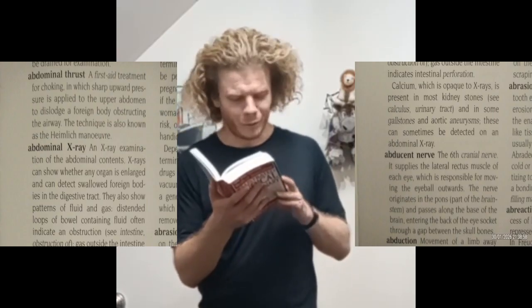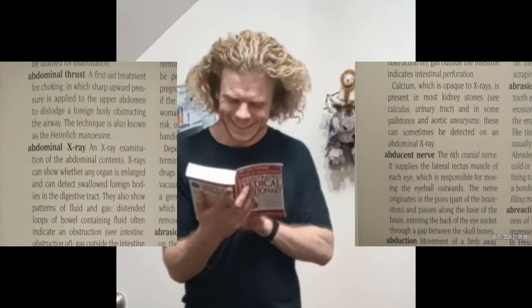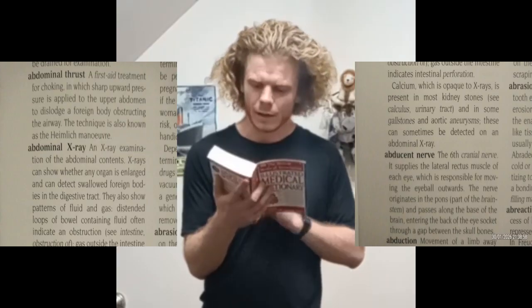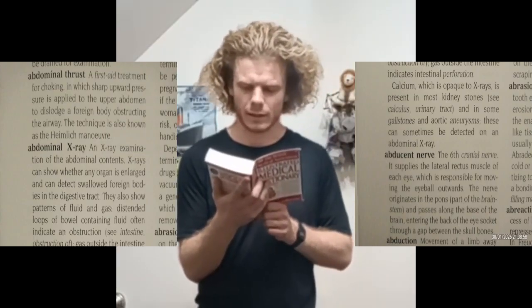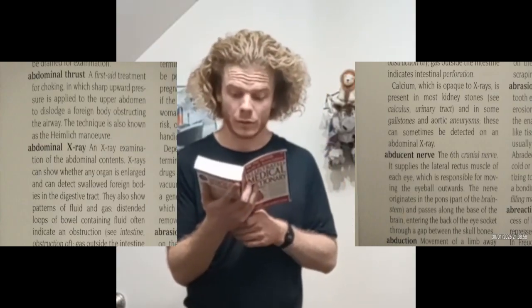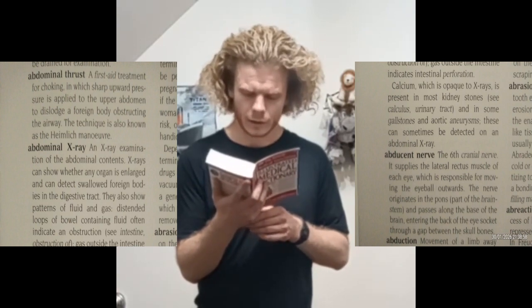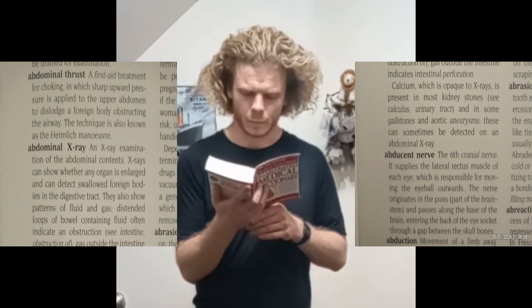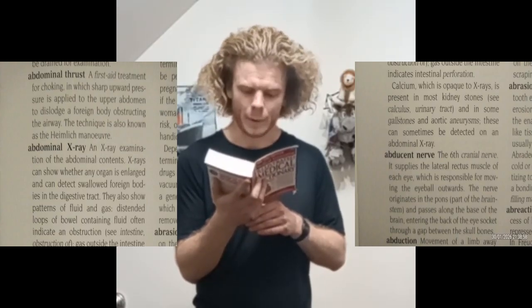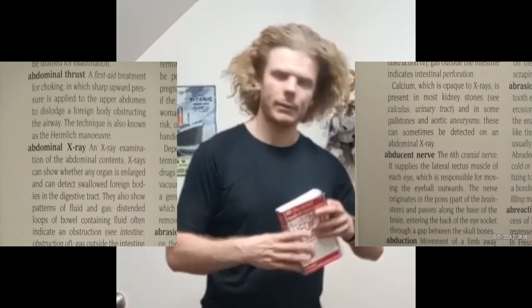A hole made in an organ or tissue by disease or injury. If there's gas outside of the intestine, that could indicate a perforation of the intestine. And it can then show calcium, which is opaque to X-rays, so kidney stones can maybe be found, or maybe also gallstones and aortic aneurysms.